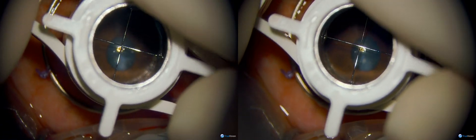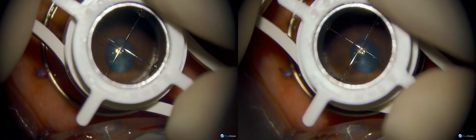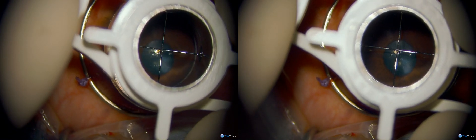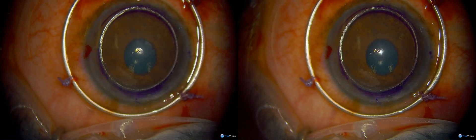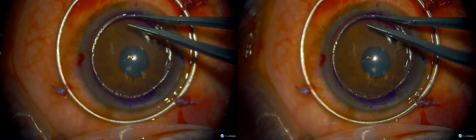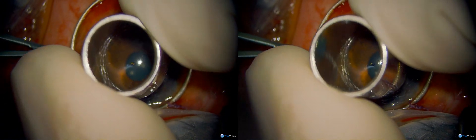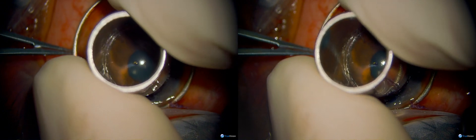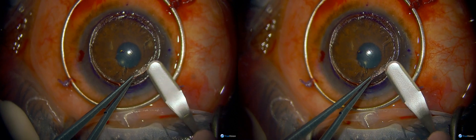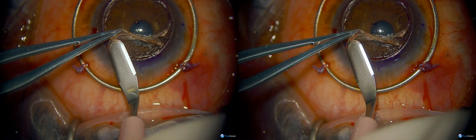You can see the pupil getting slightly bigger there, indicating the AC was deepening. In this technique of DALK, Dr. Menon is going to do partial trepanation in order to dissect off the free cap before making the big bubble. She's doing some quarter turns on the trephine here, and after achieving adequate depth she removes it to investigate how deep she made the cap. It looks like it was not deep enough on the right side, so she does a little more hand trepanation, then using a crescent blade and 0.12 forceps you can see the full dissection of the cap and the rough underlying stroma.